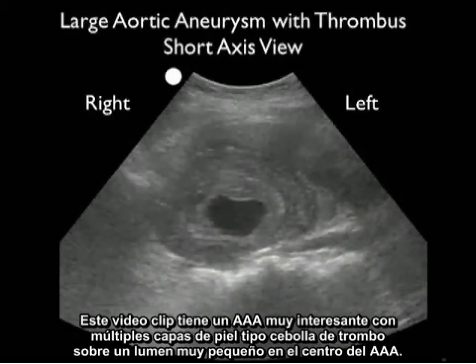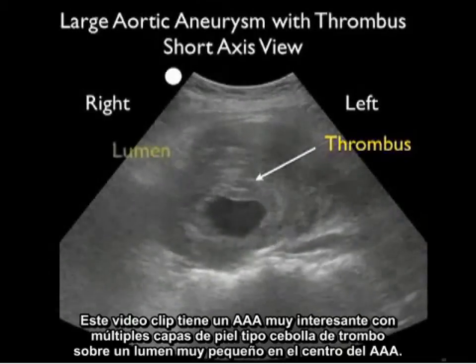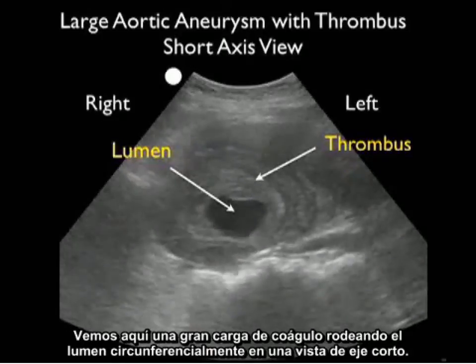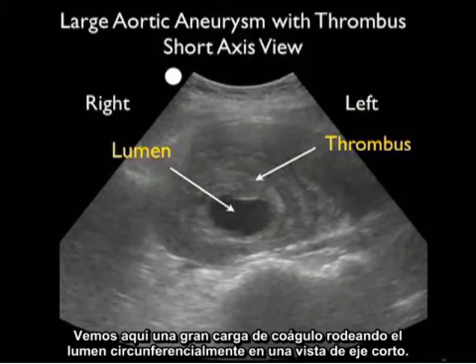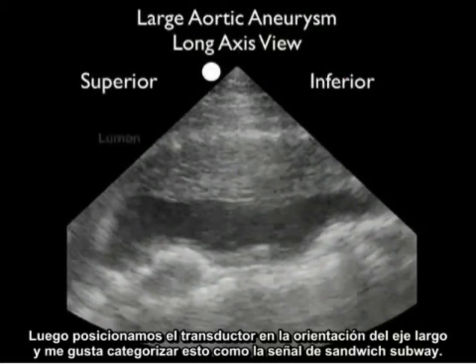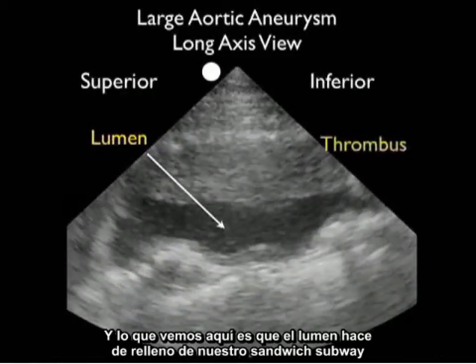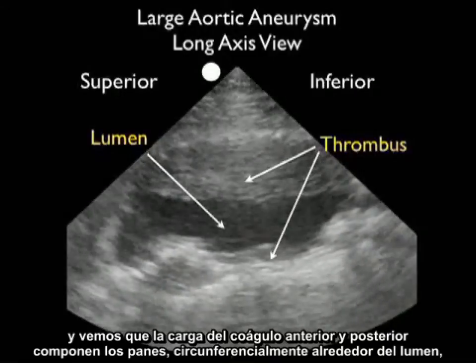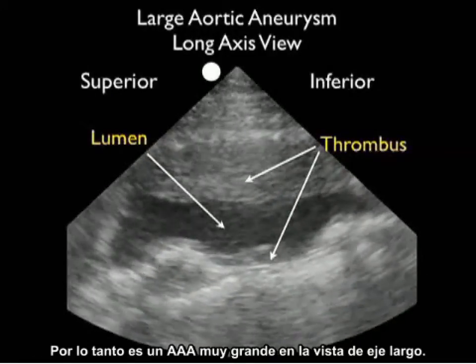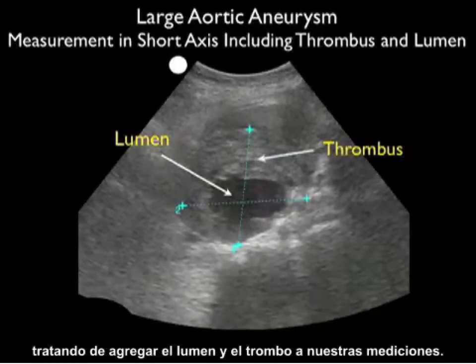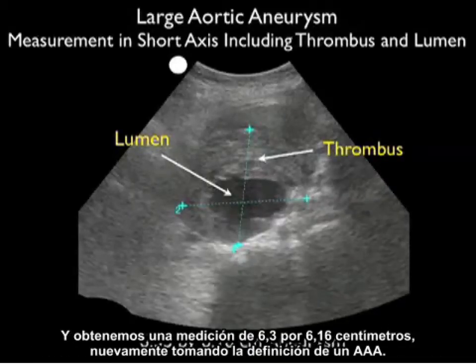This video clip shows an AAA with multiple onion skin layers of thrombus surrounding a very small lumen. Measuring only the lumen would vastly underestimate the true dimensions. In long axis orientation, I categorize this as the subway sandwich sign — the lumen forms the filling, and the anterior and posterior burden of clot forms the loaves of bread surrounding it circumferentially. Measuring with calipers from anterior, posterior, and laterally including lumen and thrombus gives 6.3 by 6.16 centimeters.